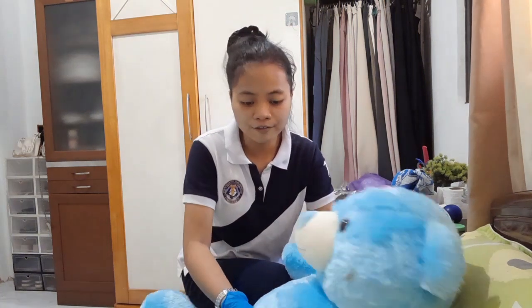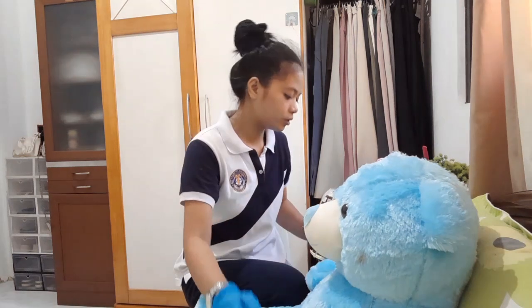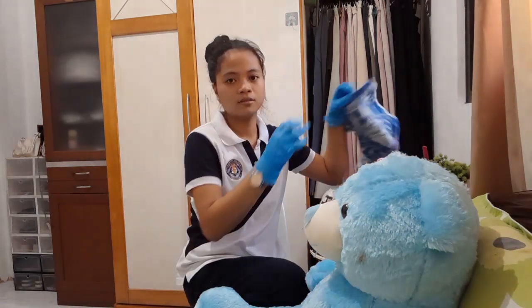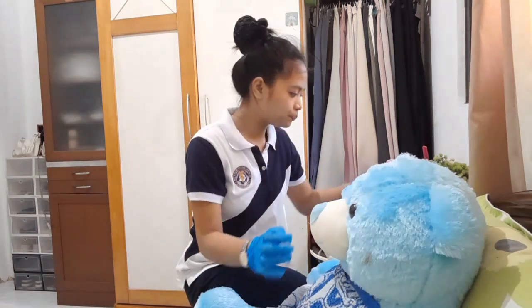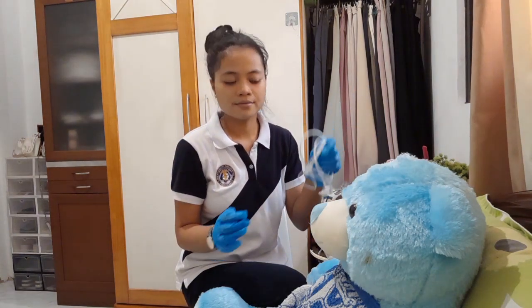So first, we're going to position the client. So high Fowler's position. Then after that, we're going to place a towel or absorbent pad over the client's chest. Then after that, we're going to select the appropriate size of the tube.